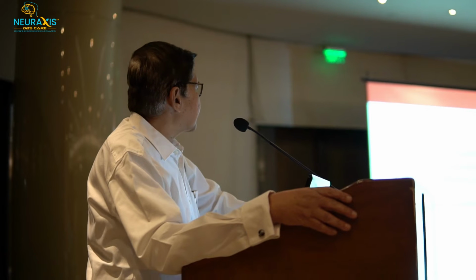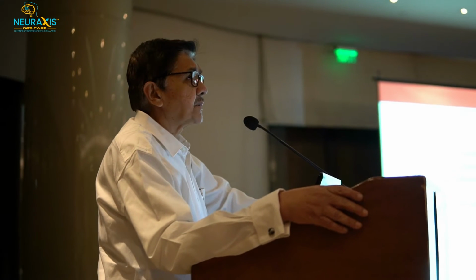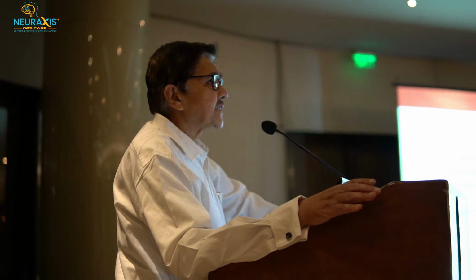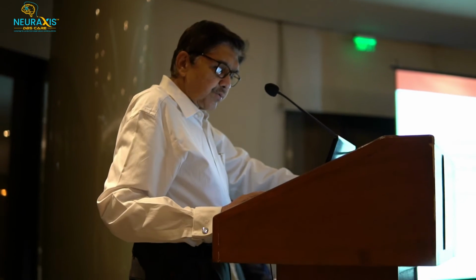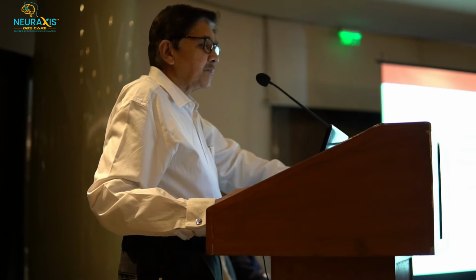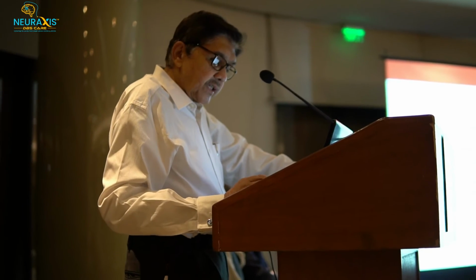At times it may be less effective if it is the secondary generalized dystonias. As I mentioned previously, the best results are seen when it is the primary dystonia. The speech and swallowing may not improve by deep brain stimulation. This I have already covered.